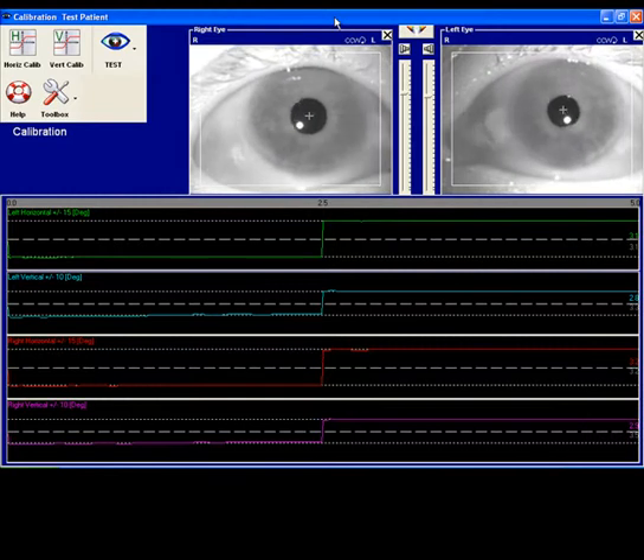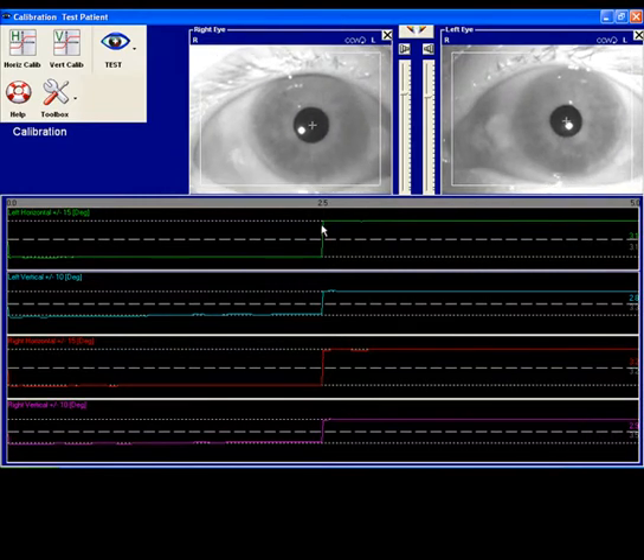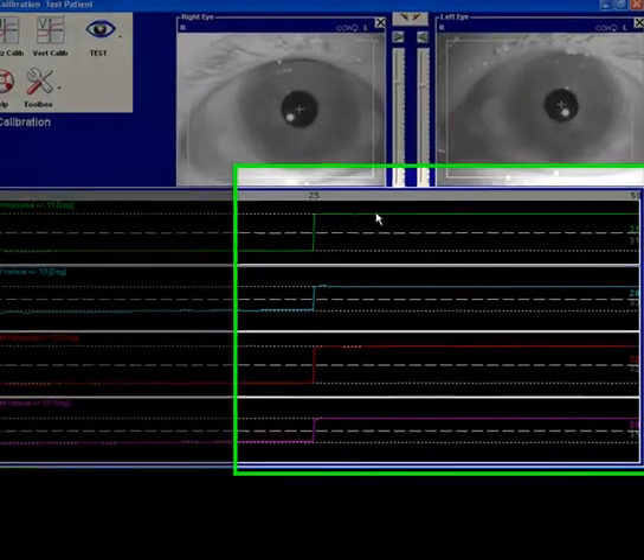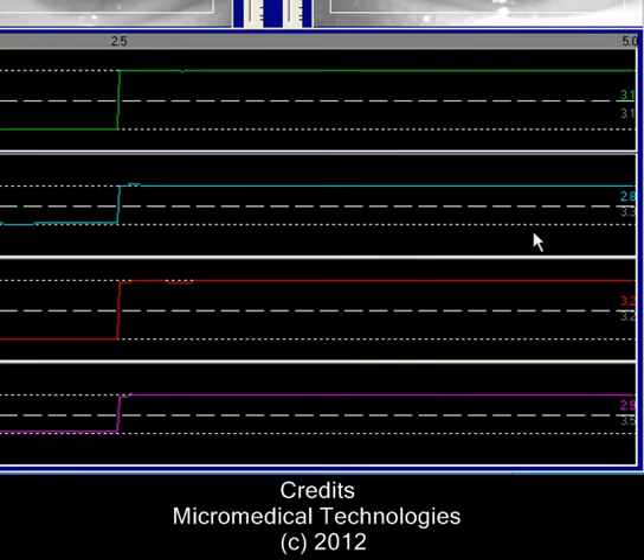What you're looking for with the results of the calibration is a clean stairstep movement of the signal itself, both for horizontal and vertical. The other item to look at is the gain. The left horizontal gain here is 3.1 and the right horizontal gain is 3.2. They should be within 0.5 of each other, and that's also for the vertical as well. If you've got a good stairstep signal and your gains are correct, you can proceed with testing.